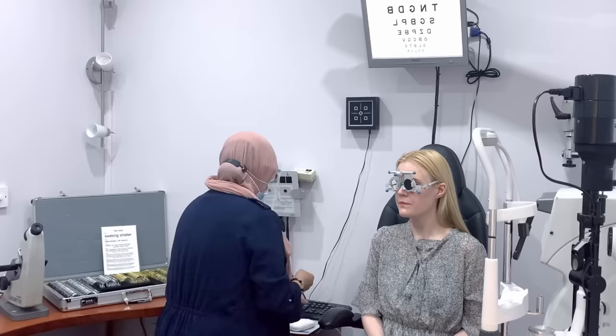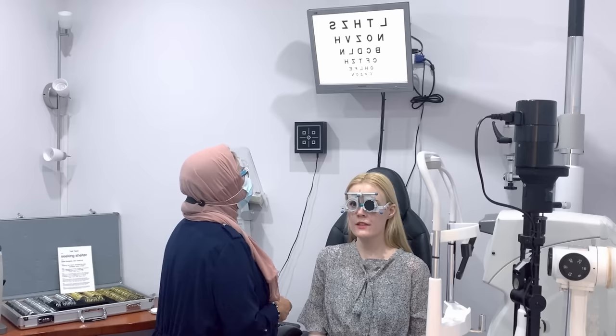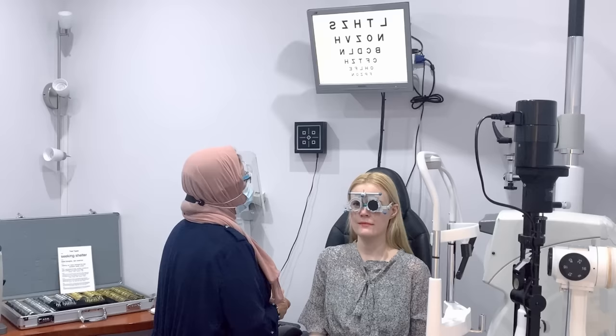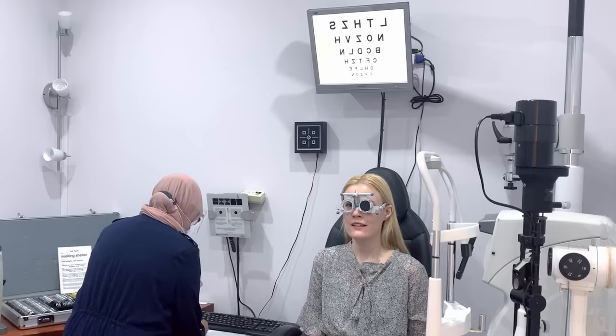Okay. If you look at the letter chart in the mirror, how far down can you go? Can you see any at the top at the moment? I can read the top one. L, T, M or H, Z and then S. Okay, and then after that it's difficult, yeah? Yeah, I could probably try. Give it a go. N, C, Z, V, and then I honestly can't tell what the last one is. That's fine.